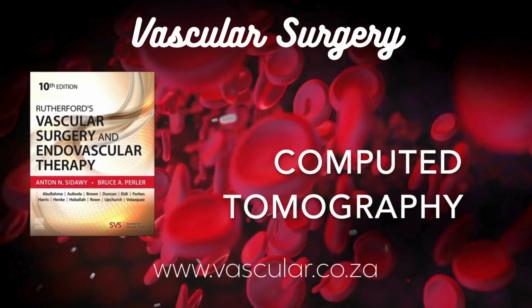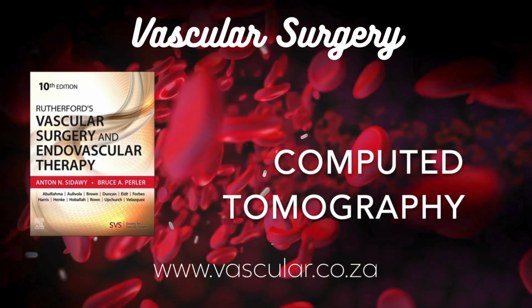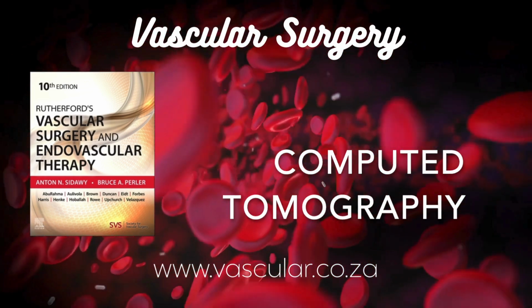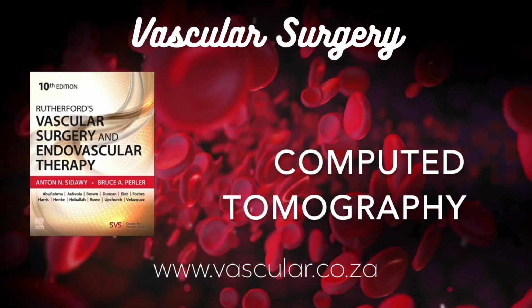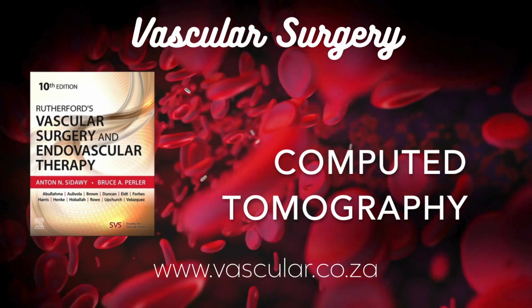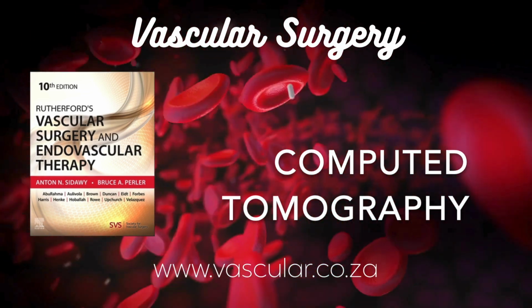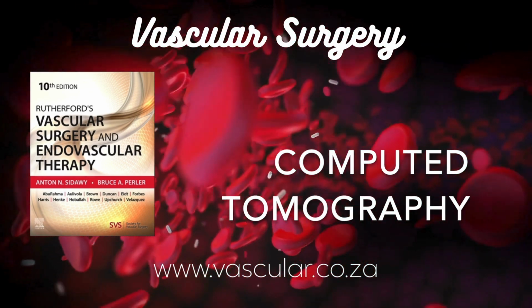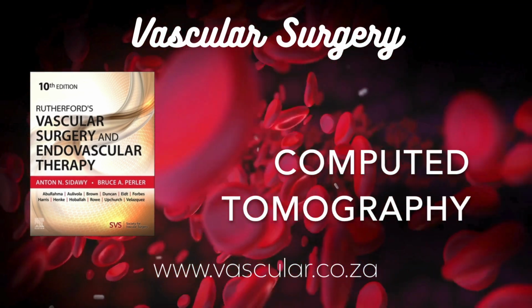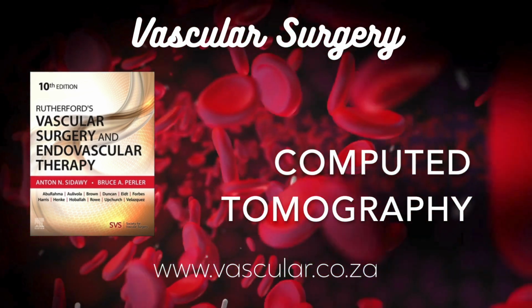Okay. And the other way? Prospective gating, or triggering. Here, the scanner uses the ECG signal to predict when the quiet phase is coming, and it only turns the X-ray beam on during that pre-selected window. So less radiation. Significantly less radiation, which is a big plus. The downside is you only get images from that specific phase you chose beforehand. If there is an unexpected finding best seen in another phase, you don't have that data.